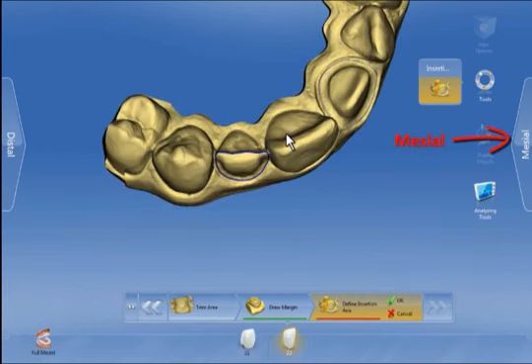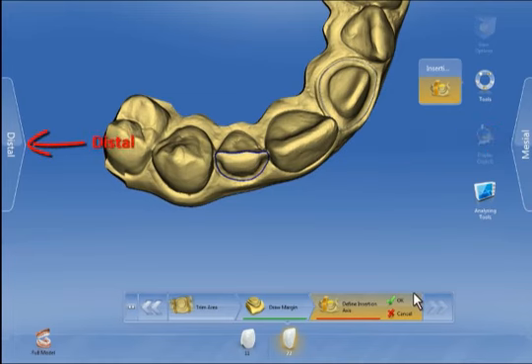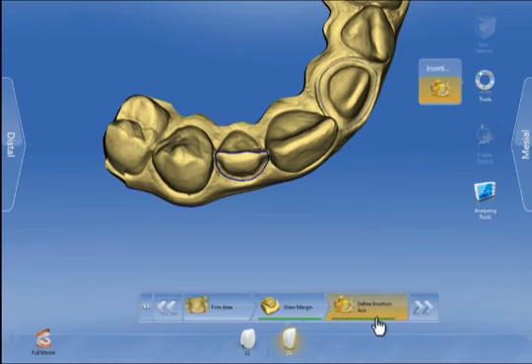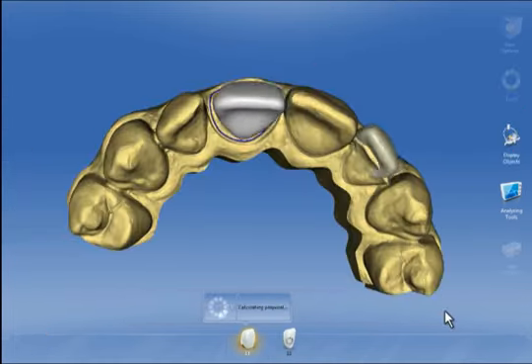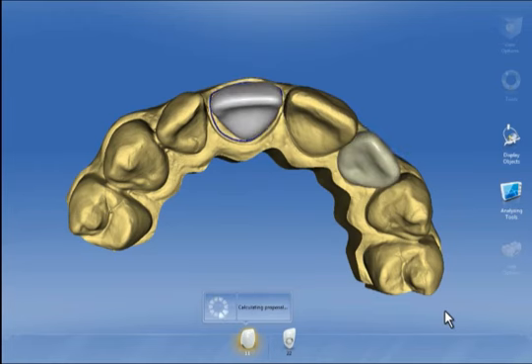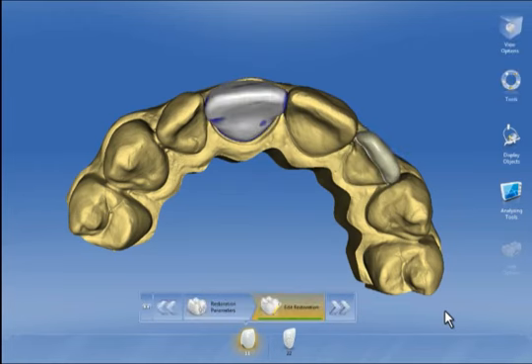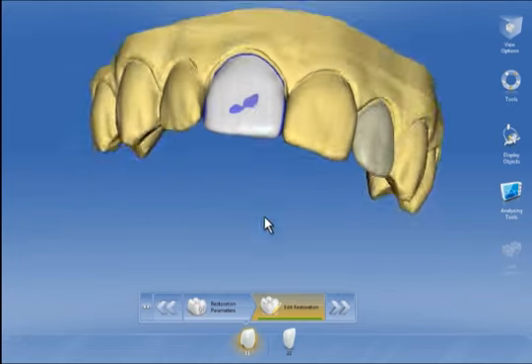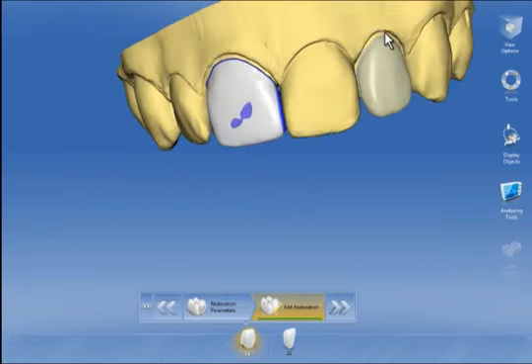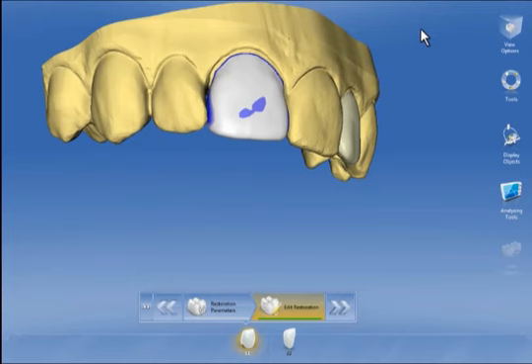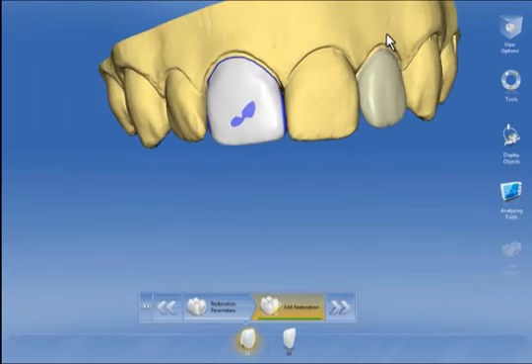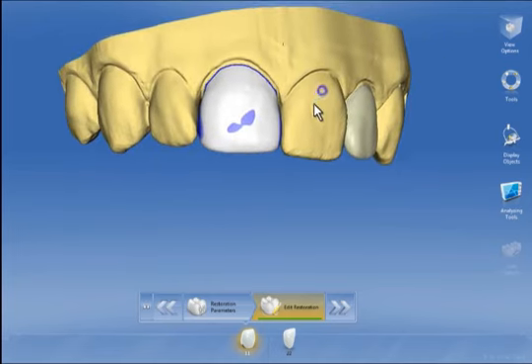We are asked to define the insertion axis for the veneer and confirm it as before. The biogeneric calculates and then suggests a proposal, which in this case is nearly perfect. We can either accept this proposal as it is or optimize it using the tool wheel before milling the restoration.